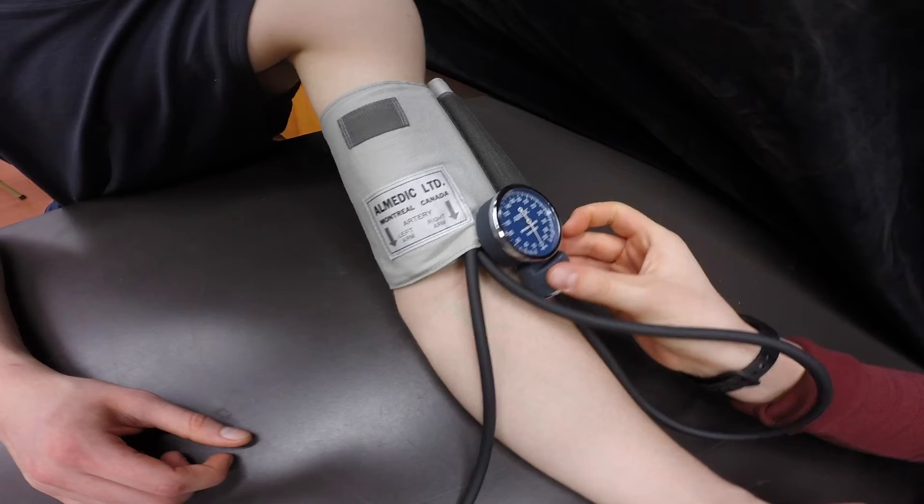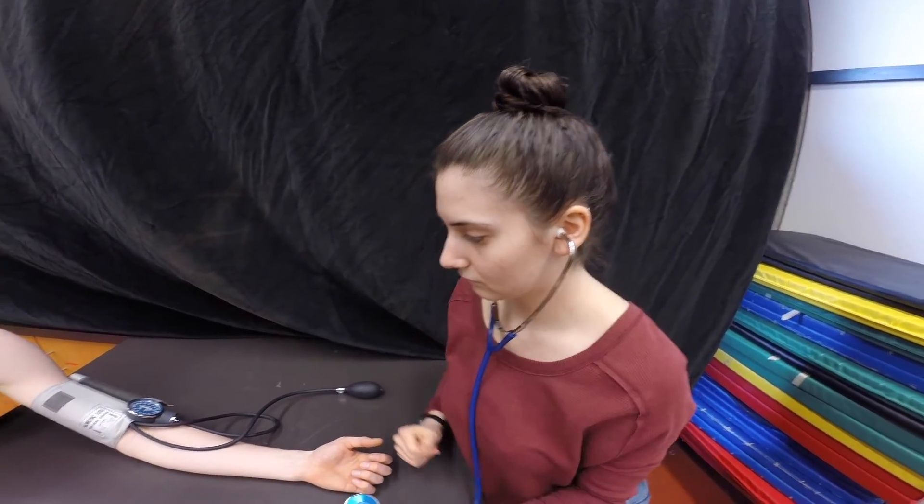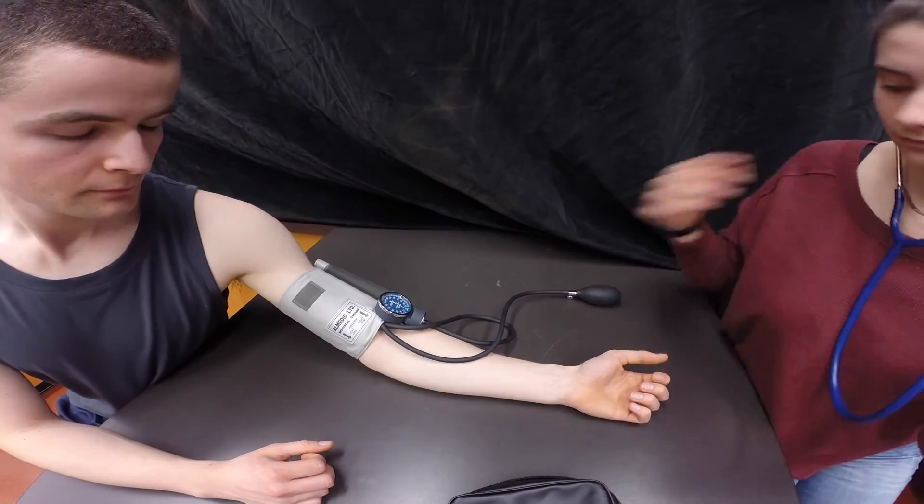You can either attach the gauge to the cuff or place it beside you. Now place the stethoscope in your ears with the ear pieces facing forward and position the head over the brachial artery.